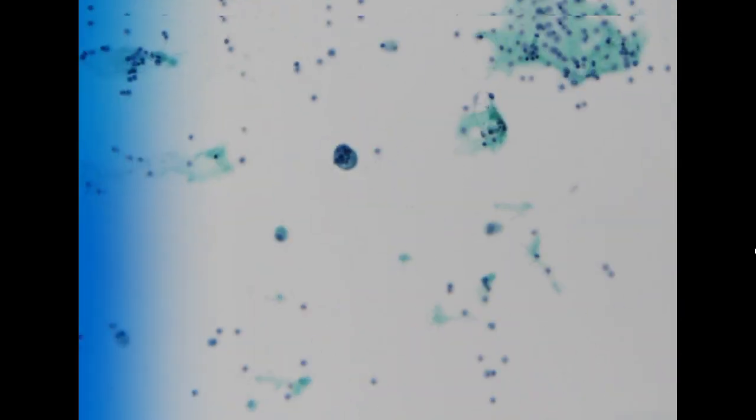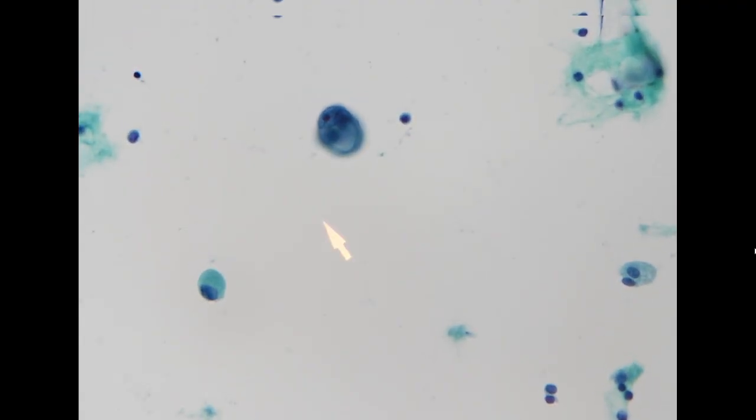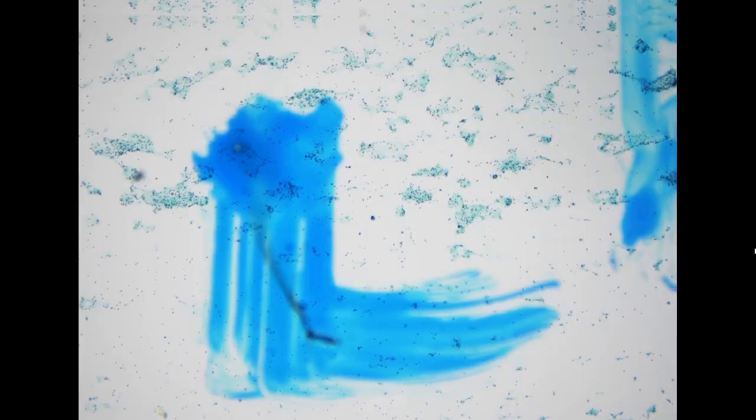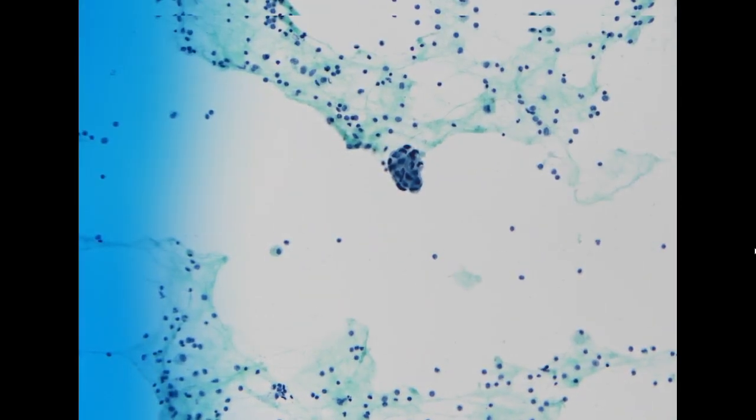If you want to tell by the morphology whether this is coming from the pancreas or from the prostate, the best that you can tell is that usually for pancreatic cancer, you will expect to see some intracytoplasmic mucin vacuoles. For prostate cancer, usually the nuclei will be more uniform instead of this highly polymorphic pattern, and they usually form small rosette-type patterns.